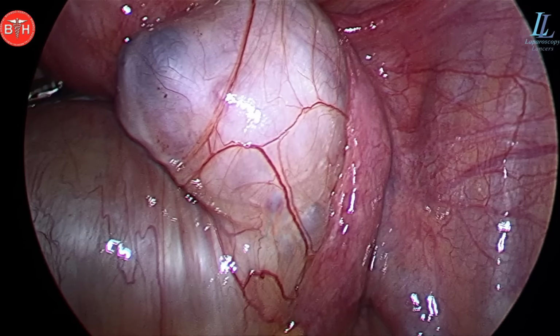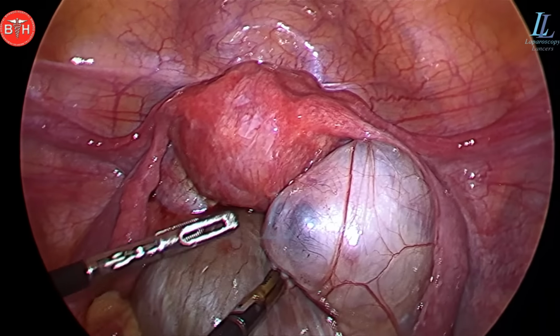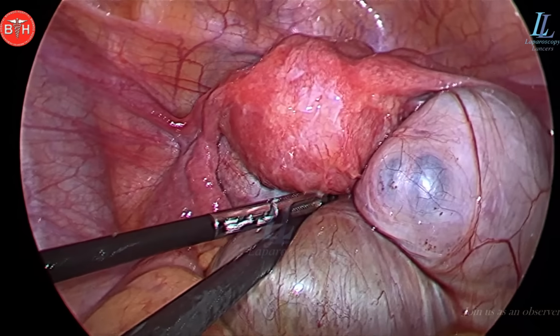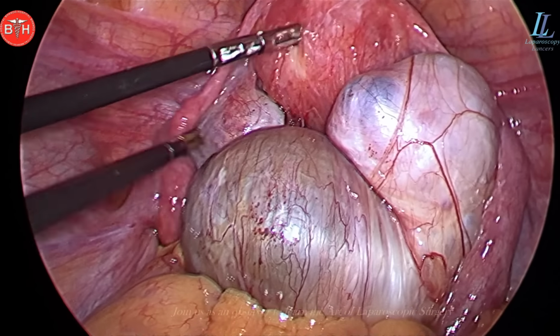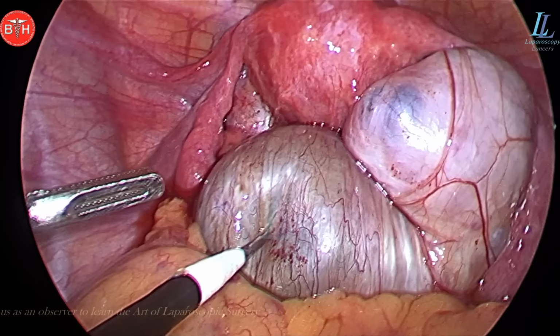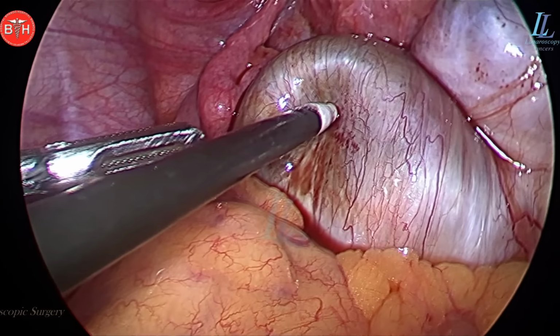The plan is obviously to do the removal of the chocolate cyst and save both the ovaries, as she is a young female with primary infertility. A chromoperturbation will be done at the end of the surgery. So I think that's what a complete surgery will be, and you can see a bit of adhesions down below in the pouch of Douglas, and there comes in the aspiration needle aspirating the chocolate cyst.